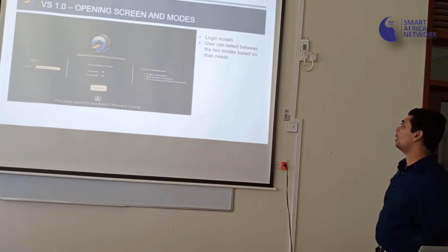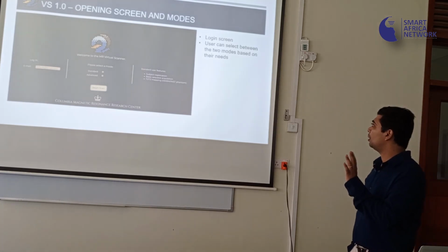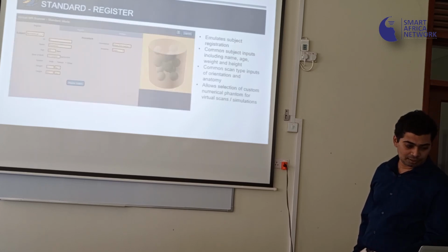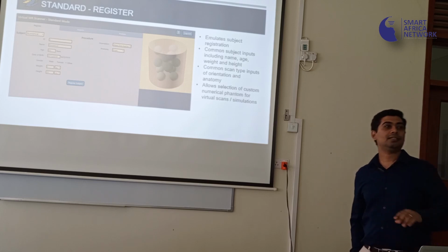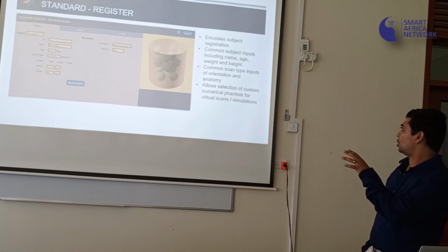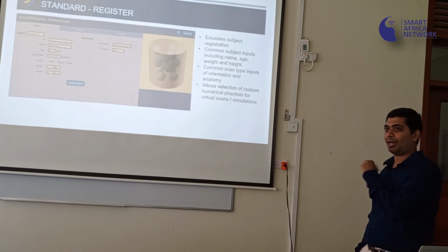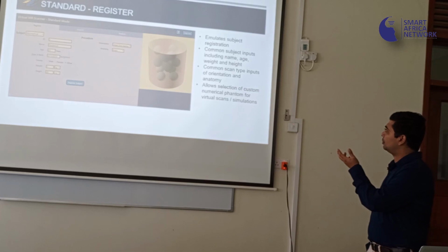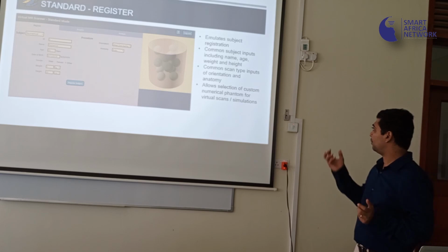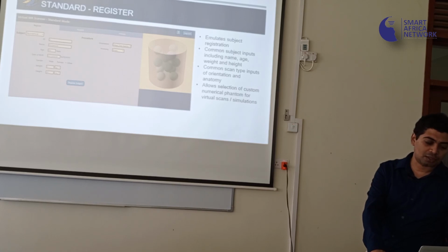The way you would go about doing it is you would log in. I think the new version does not have the Columbia logo anymore, but you log in using an internet browser, and then you get to the registration page. This is very similar to what you would do on a clinical scanner. Instead of a patient, we are registering a phantom. And you have a bunch of options on the phantom here. Geva, my student, has good creative skills, so she's made this phantom with a bunch of balls with different copper sulfate concentrations in them. But the experience is very similar to running a scanner.